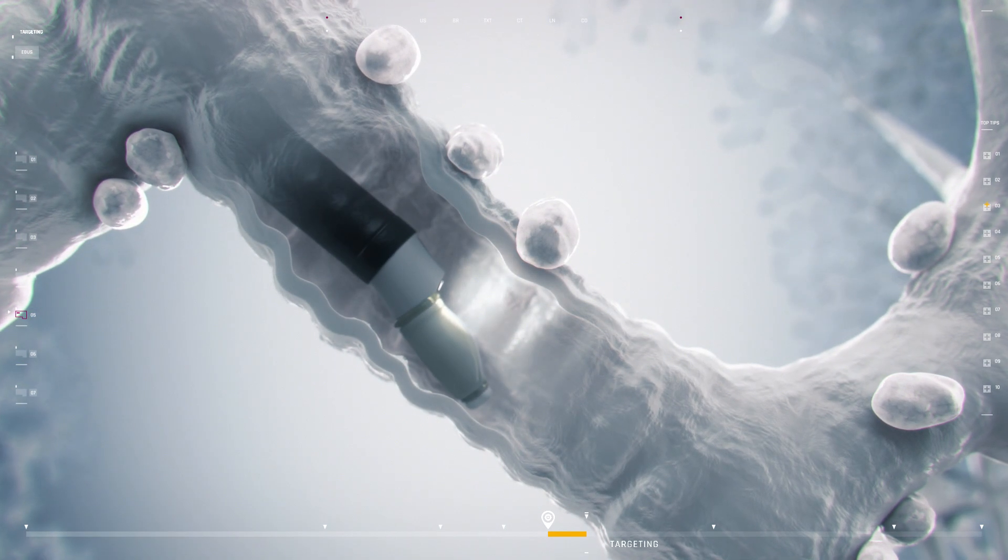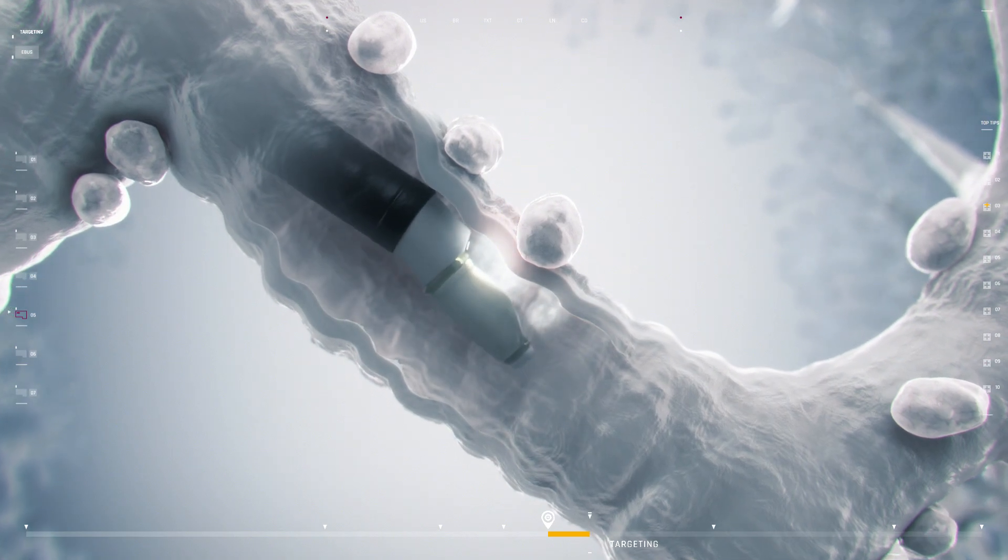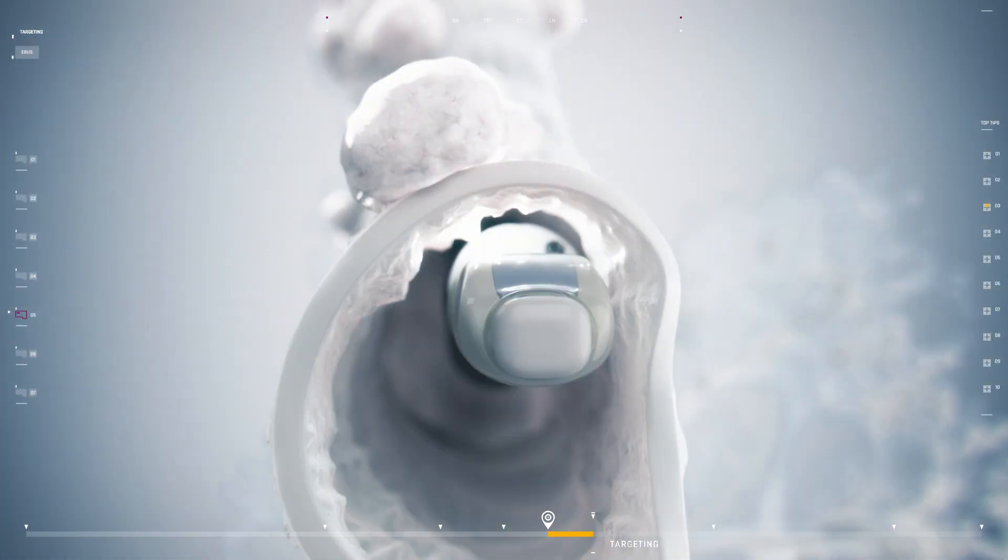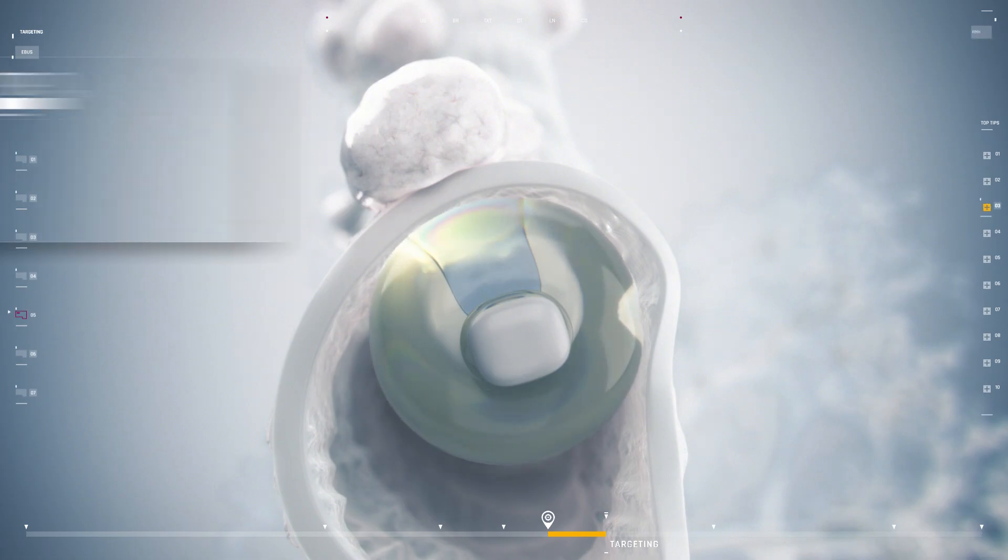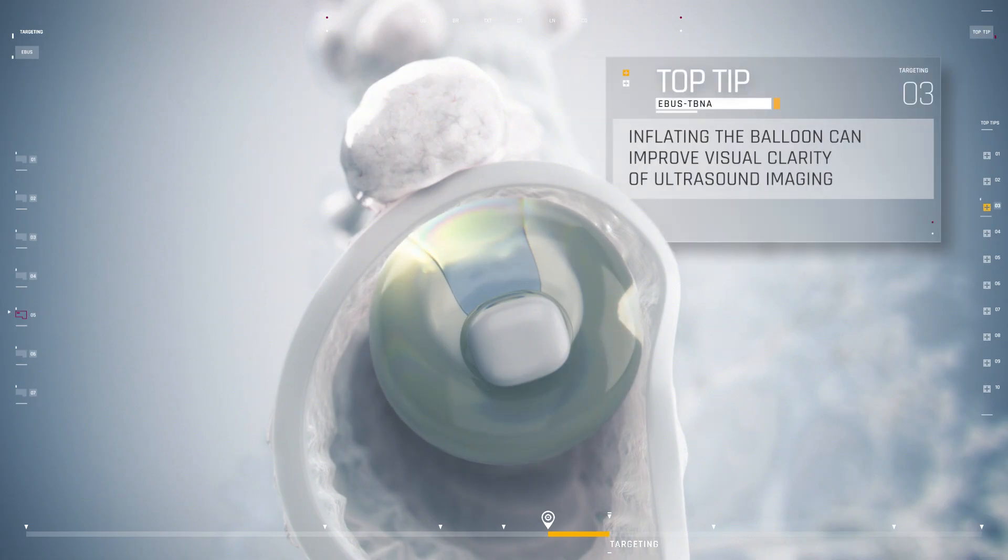Once the EBUS scope is positioned at the approximate location of the target area, the scope is flexed to gain contact with the airway wall while being rotated from side to side to obtain the image of the target lymph node. Inflating the balloon on the tip of the bronchoscope with saline may be necessary to maintain good contact between the airway mucosal surface and the probe, optimizing image quality.